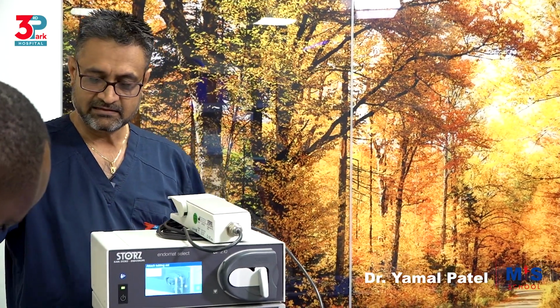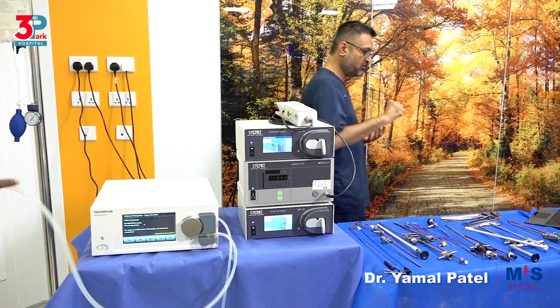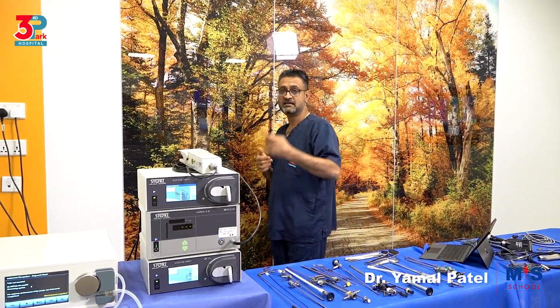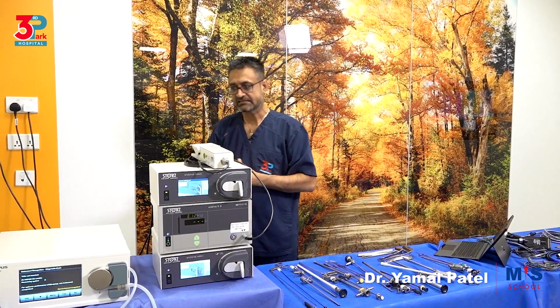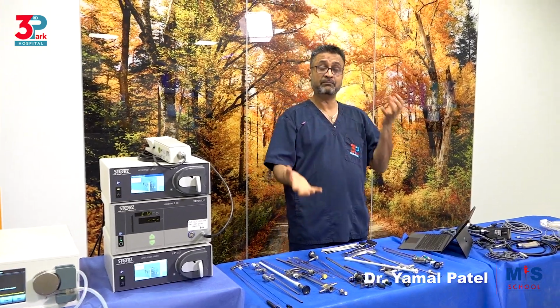Hysteroscopy. So we have a fluid management system that involves the pressure and the flow, and then you also have fluid management systems, as you will see there with the Medtronic system, where they have the in and out measurement.